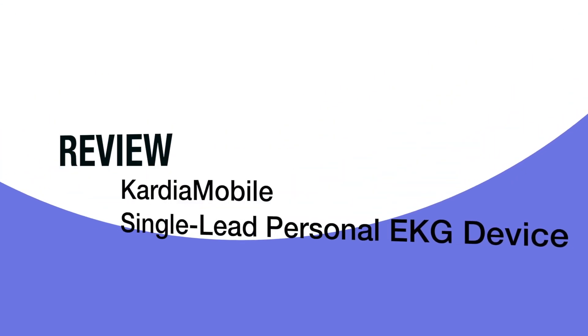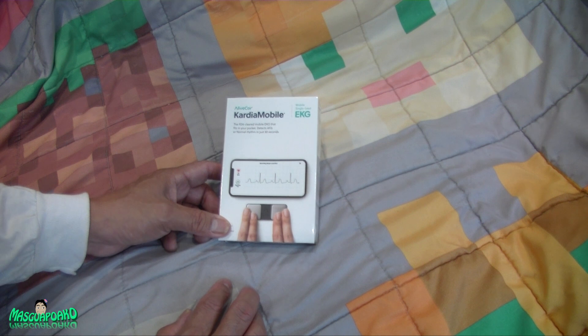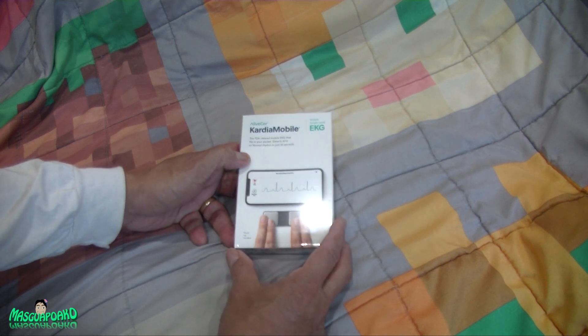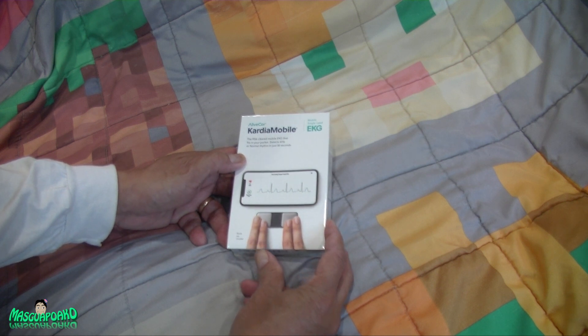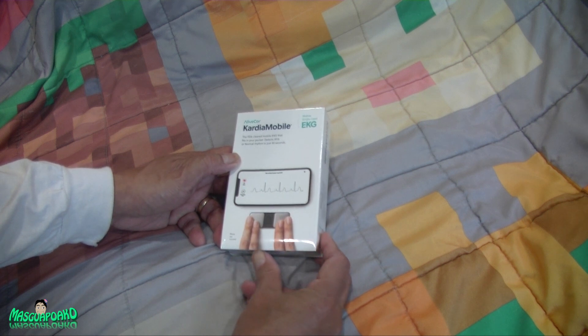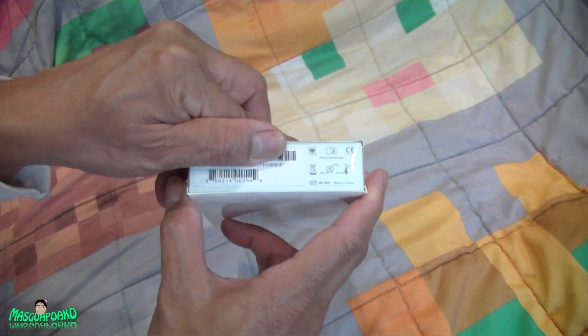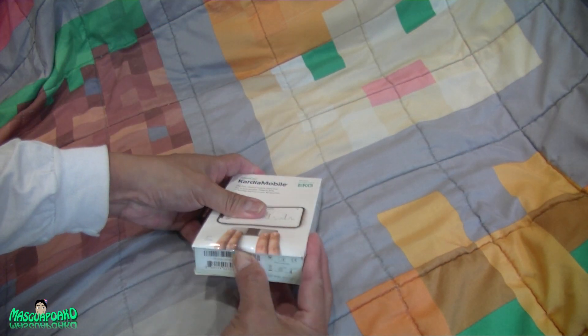Hey everybody, what I got here is an AliveCor Cardia Mobile — it's a single-lead EKG machine reader, whatever you want to call it. You need a phone for it to read your results. I took a class a long time ago and I don't really remember much anyway. This is the Cardia Mobile EKG — it fits in your pocket and detects AFib or normal rhythm for 30 seconds. Let's unbox this one.